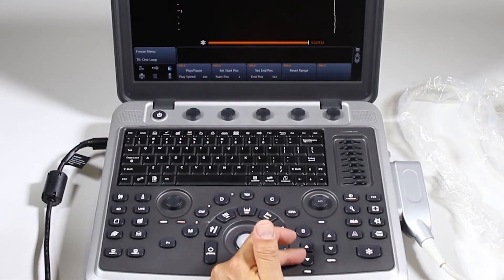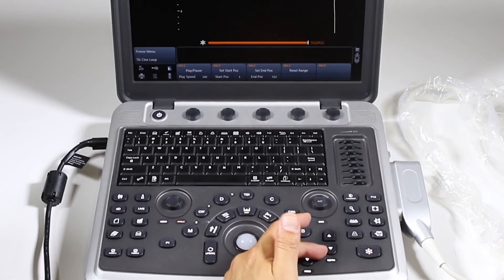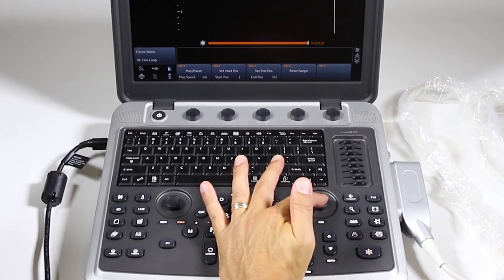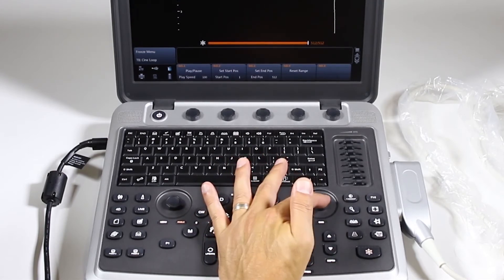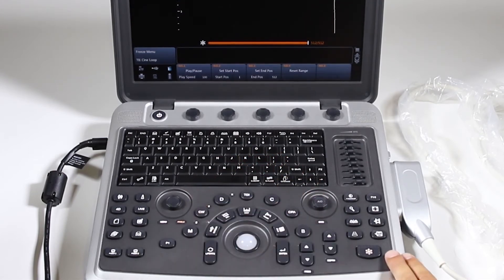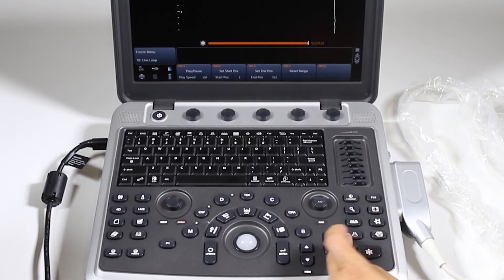Change the frequency of your transducer. Change the depth. You have your gain here and automatic image optimization at the press of a button. Going up, you have your freeze. Save.